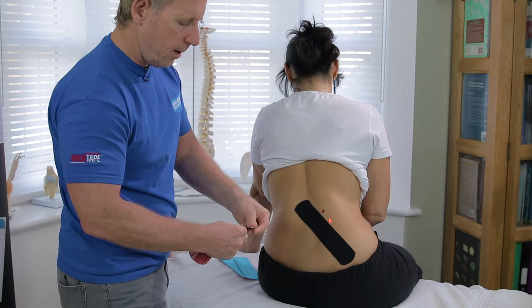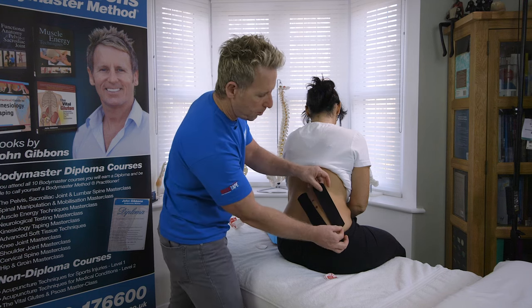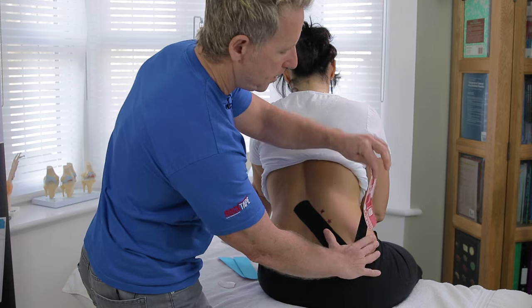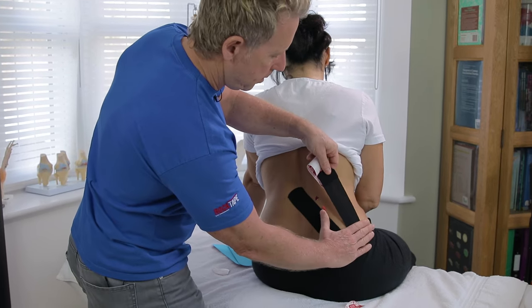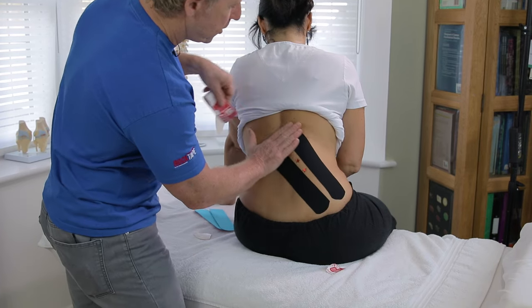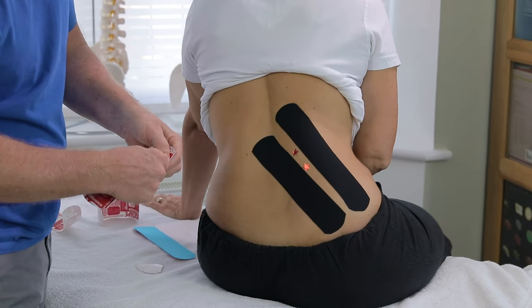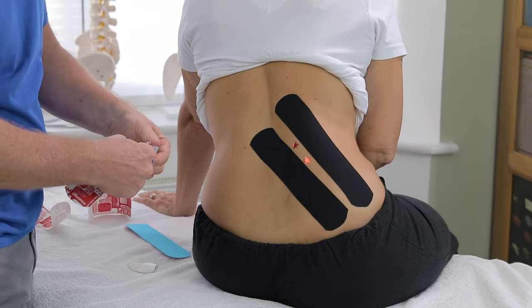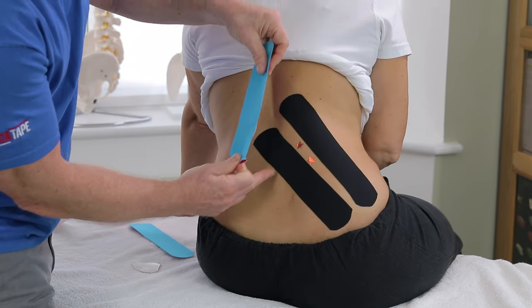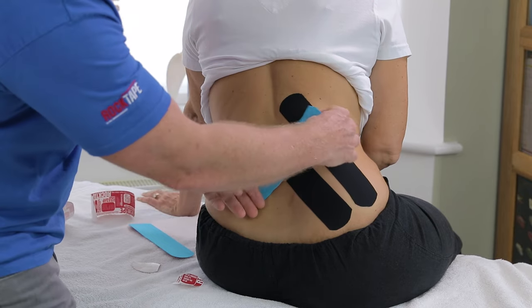For the second strip, I've peeled it off this time — just showing you the separate method. Contact it, pull it, peel it, and again apply 25 to 50% stretch across the area. So you're going above and below the area of pain for the first two strips. For the next two, I'm going to start where the pain is and go inferior around there, applying that and locking it down.